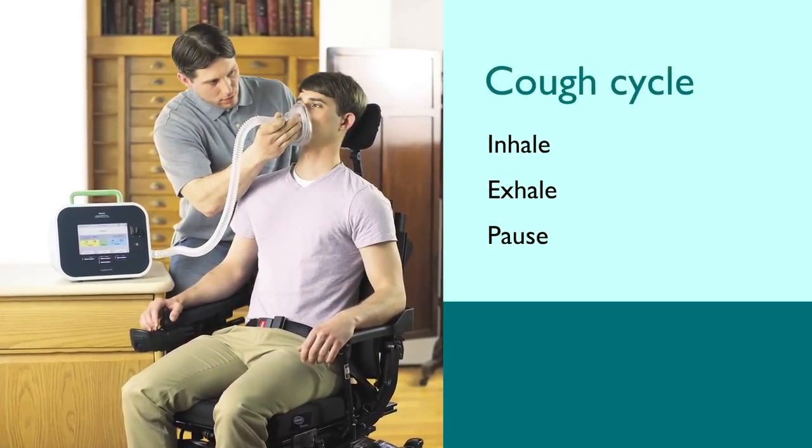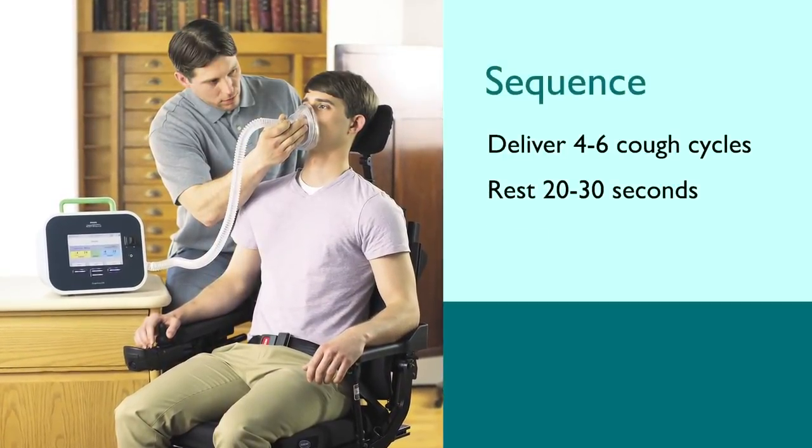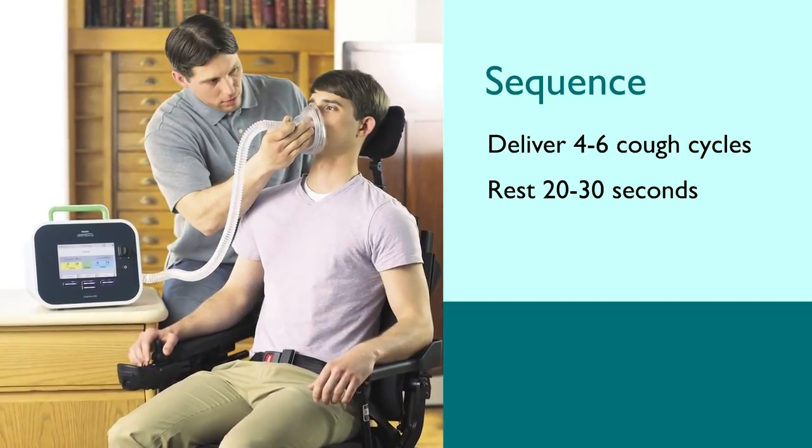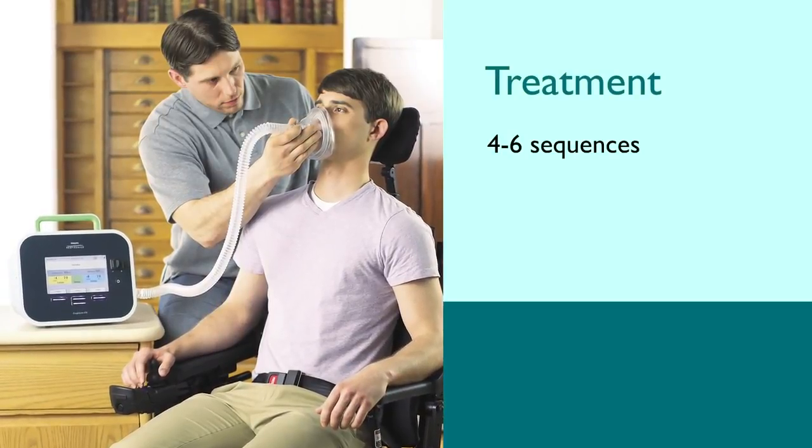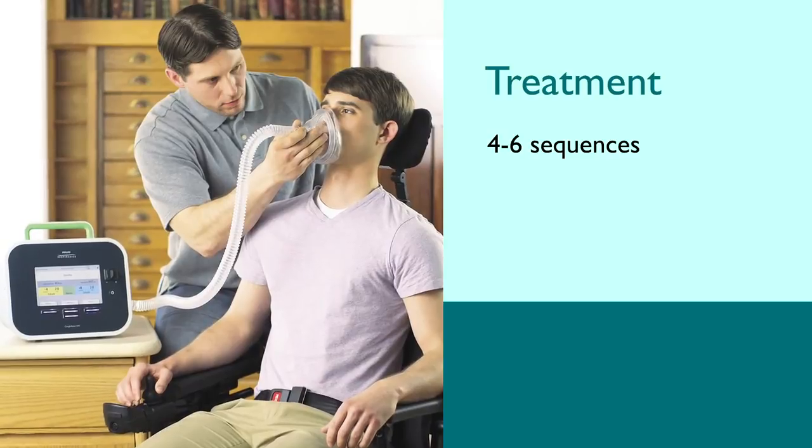A cough cycle is defined as inhale plus exhale plus pause time. Deliver four to six cough cycles in rapid succession followed by a rest period of 20 to 30 seconds. Repeat this sequence, four to six cough cycles and rest period, four to six times for a complete treatment.